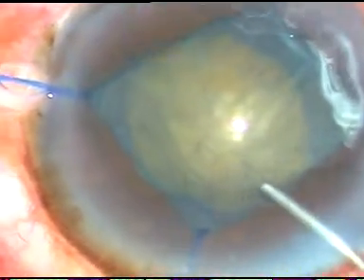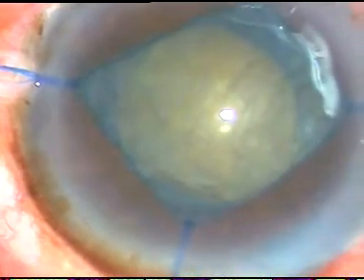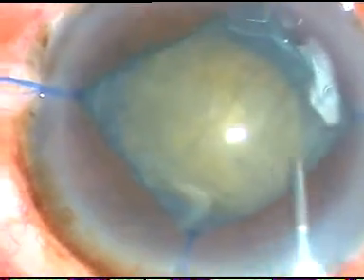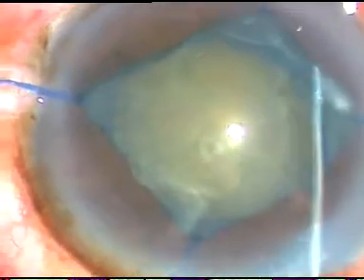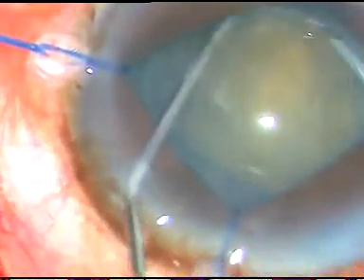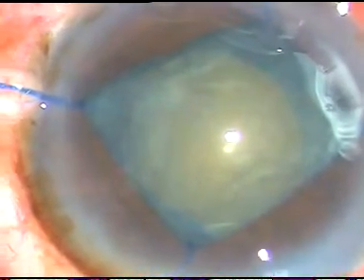Now I am doing hydrodissection. The rhexis size is adequate, but otherwise I would have done a bit larger rhexis in this case, because in hard cataracts I always prefer a large rhexis — about a six millimeter rhexis.